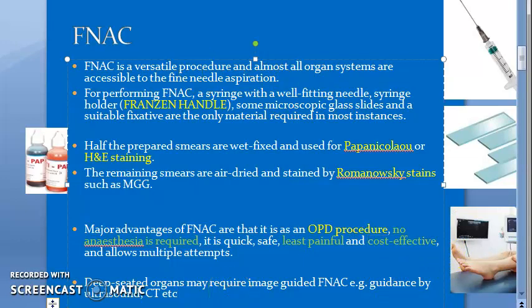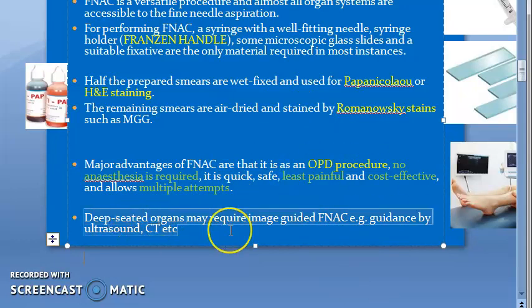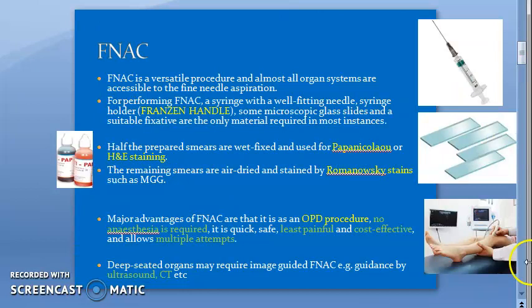Then you can do multiple attempts. These are the major advantages of FNAC. Now, for deep-seated organs, you may need a longer needle and you'll also need guidance by ultrasound, CT, etc. Okay, so this is a very brief overview of FNAC.